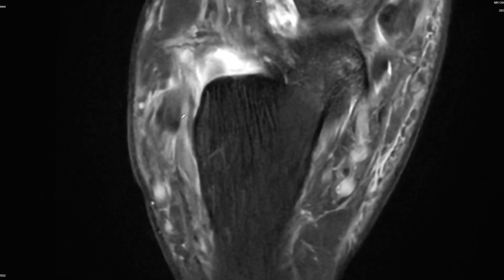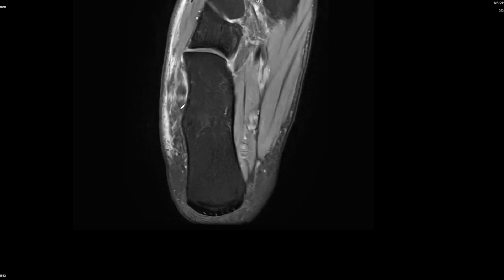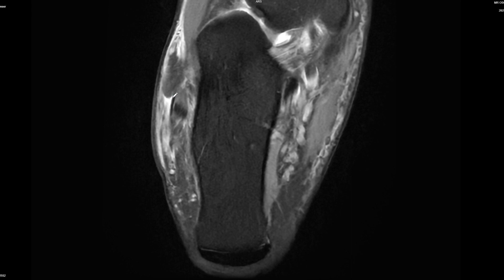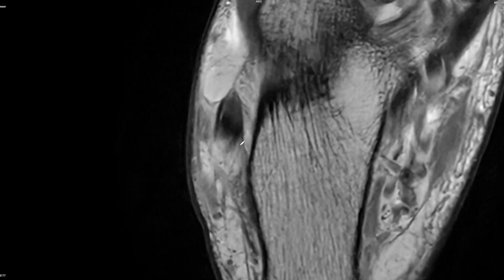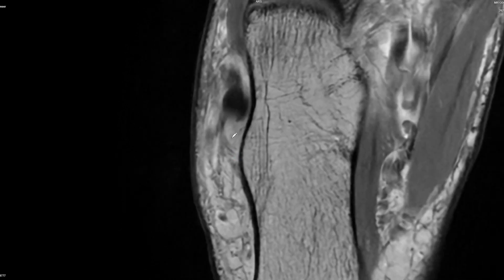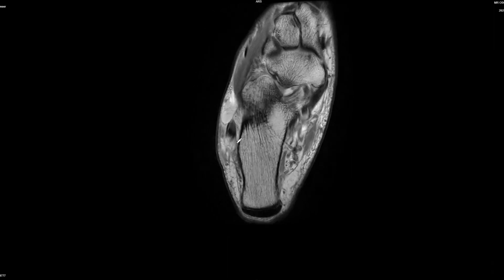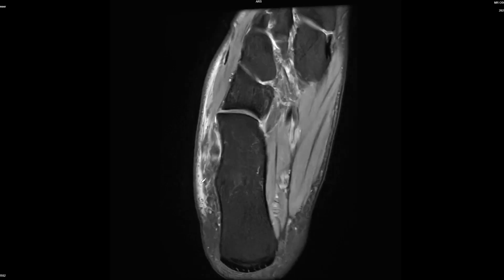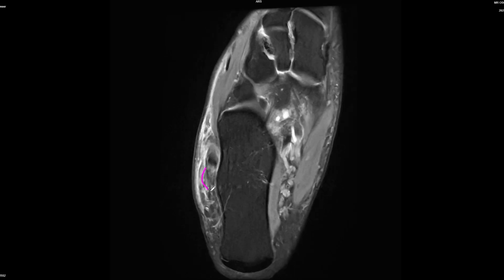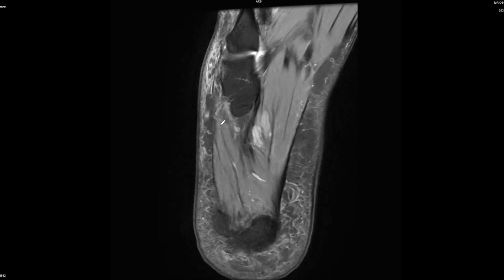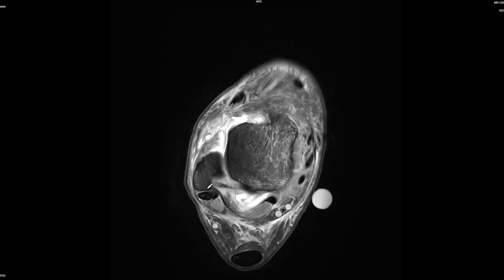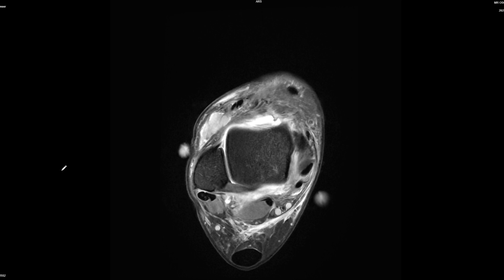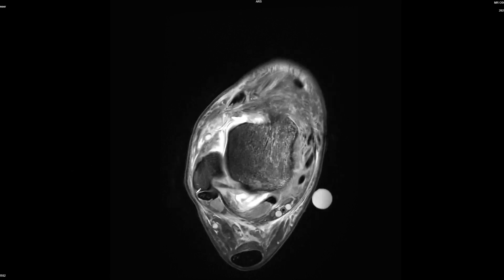For the peroneal tendons I don't see a definitive split injury. Some of the linear lines may be part of the retinaculum rather than the tendon itself. Some people described an injury to the superior peroneal retinaculum, which I think is very sensitive, but I don't see enough edema to consider this a major finding. I did not use the peroneal tendon as a major or minor qualifying criteria.